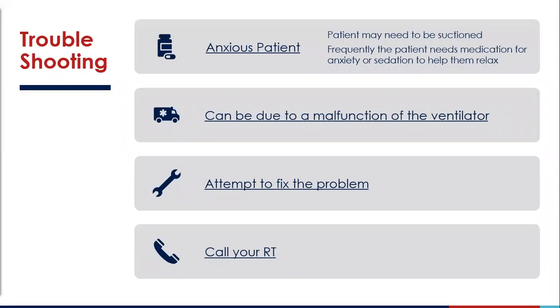It can also be due to a malfunction of a ventilator. Attempt to fix the problem and always call your respiratory therapist. When in doubt, remove the patient from mechanical ventilation. Provide respirations with an AMBU valve bag until respiratory can provide more resources.